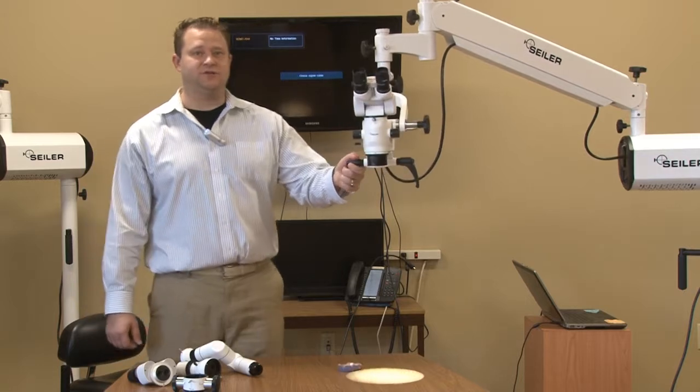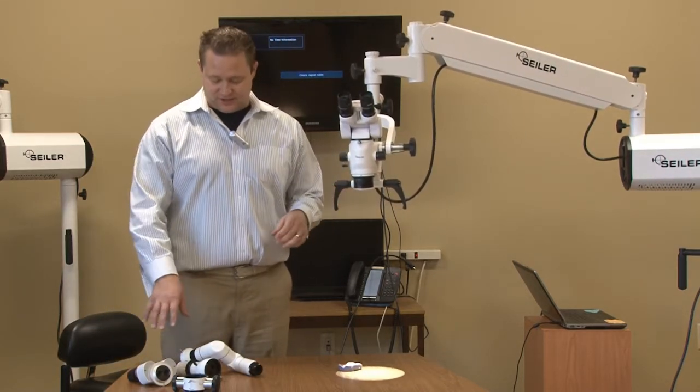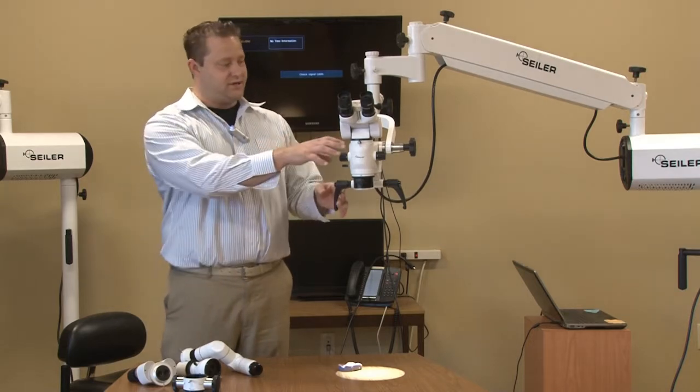Hi, I'm Dane Carlson, Division Manager of Seiler's Medical Division. Today what I want to show you is Seiler's assistant head setup.